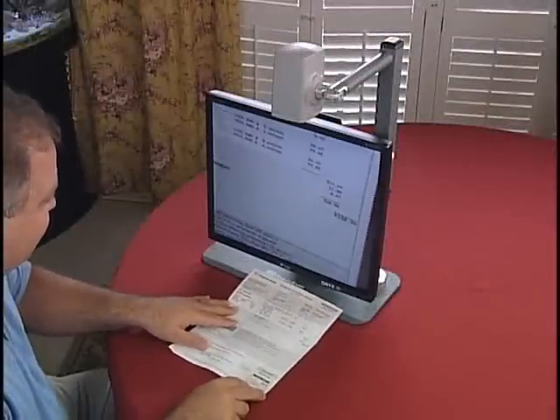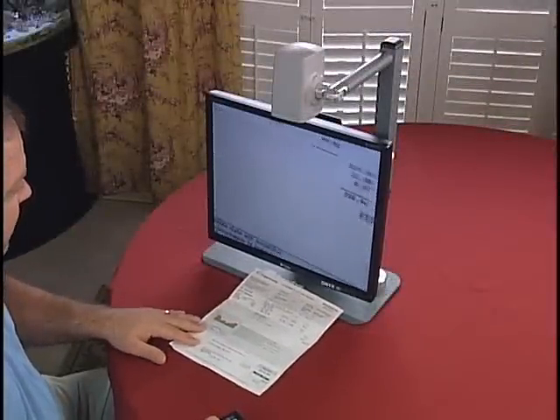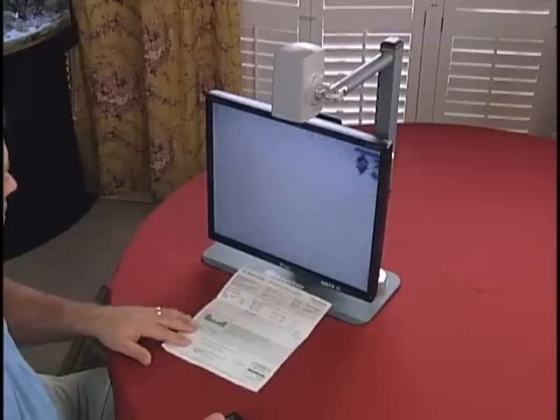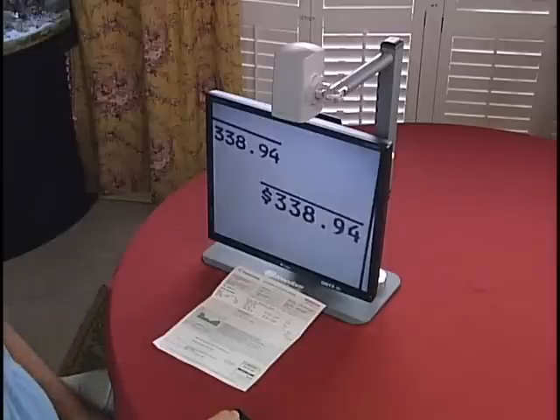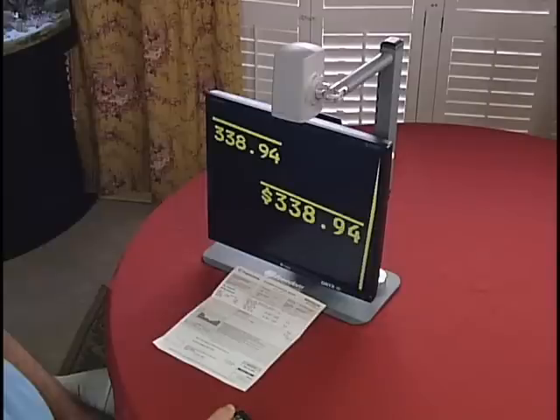When I get to something important, like my electric bill, my Onyx helps me see it clearly, magnify the amount due, even enhance the contrast to be sure I read the amount correctly. Jeepers, $338.94. I wouldn't believe it if I hadn't seen it with my own eyes.